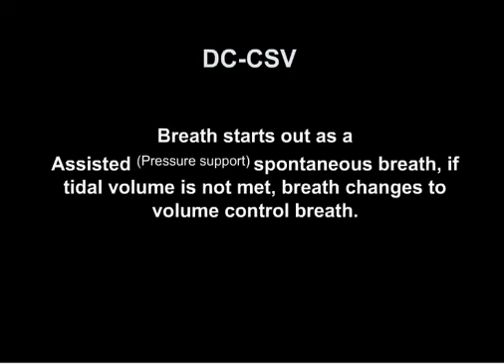Dual control CSV. With dual control CSV, the breath starts out as an assisted spontaneous breath. If tidal volume is not met, the breath changes to a volume control breath. And I don't have any slides or pictures or examples of this.